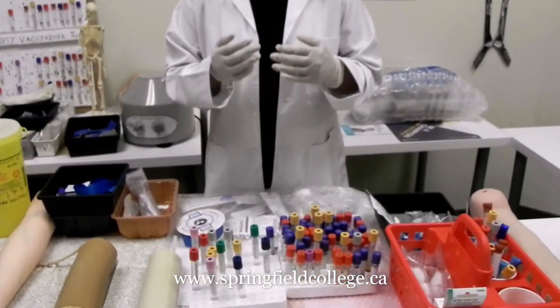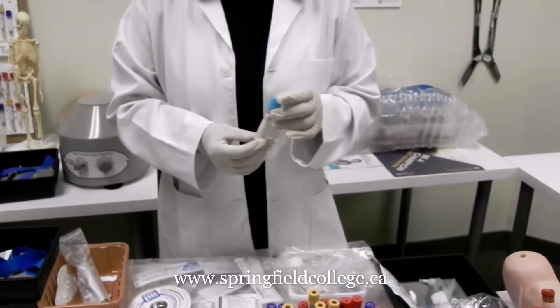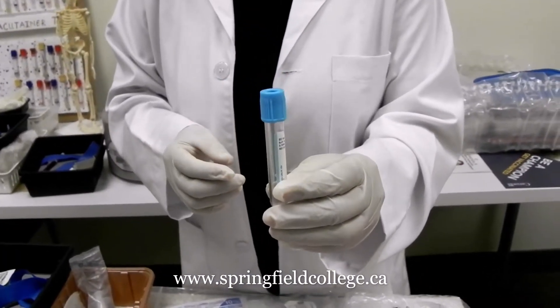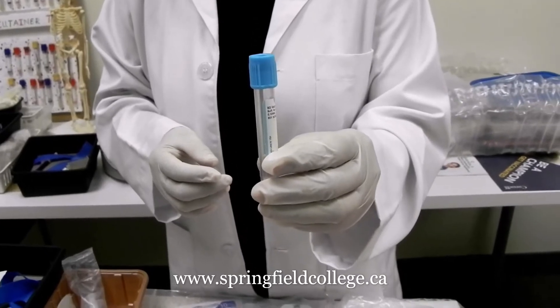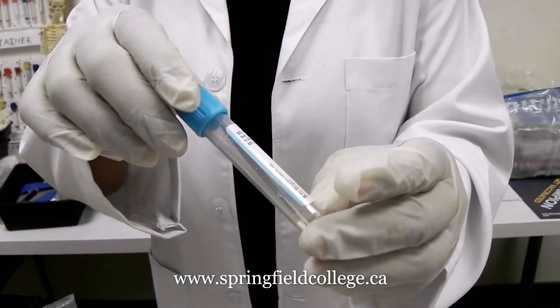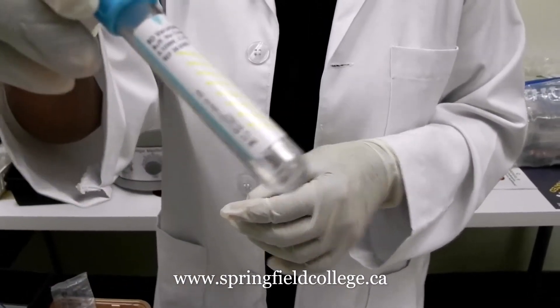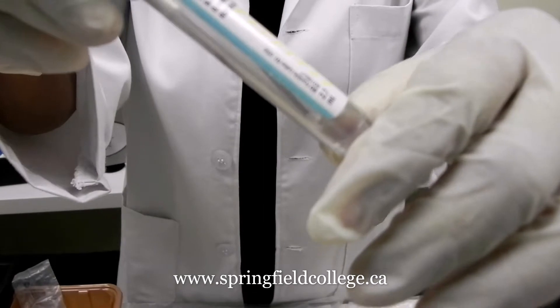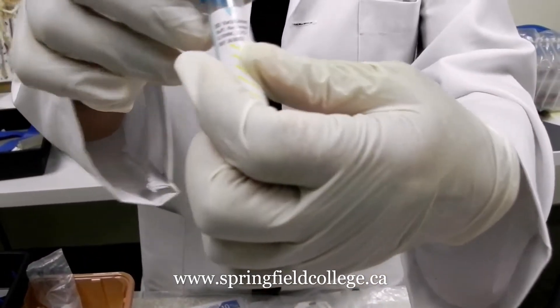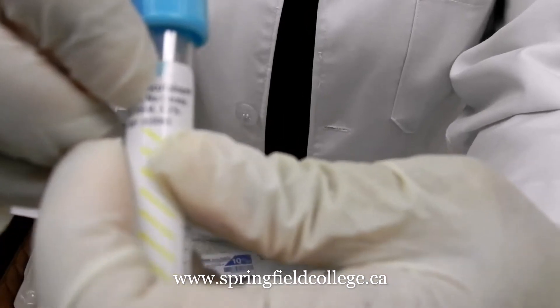As per the order of draw, the number one tube which we use is the light blue tube, which is having sodium citrate as an additive. This is the tube — you can see a small droplet, like a water drop — this is sodium citrate as an additive. On the tube you can see the mark indicating until what level we need to fill up the tube.